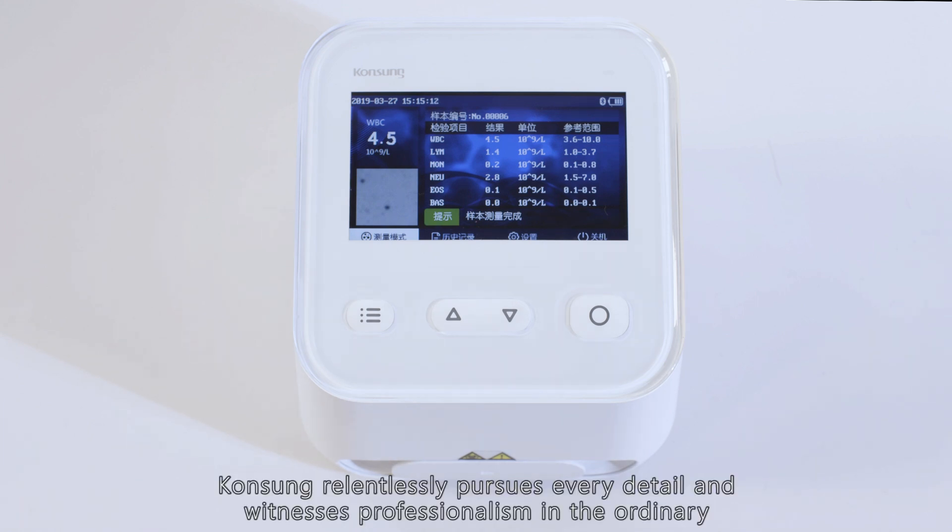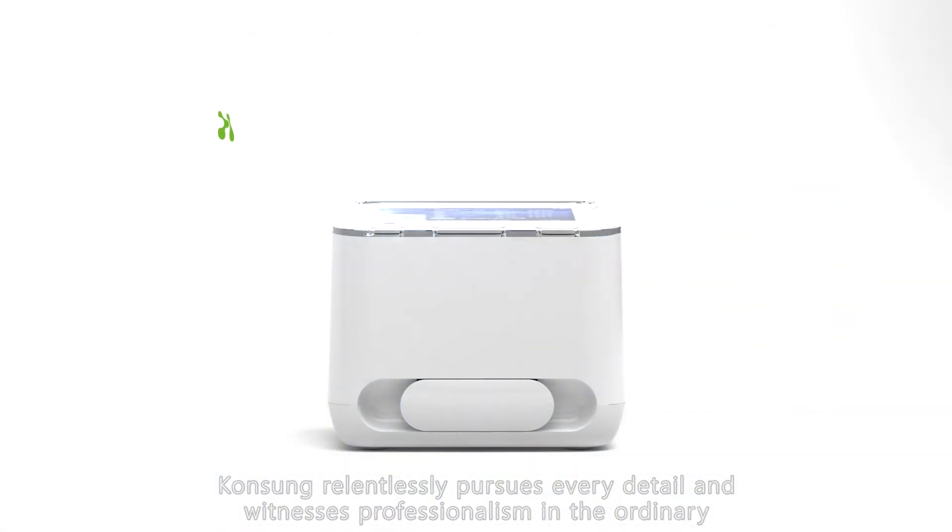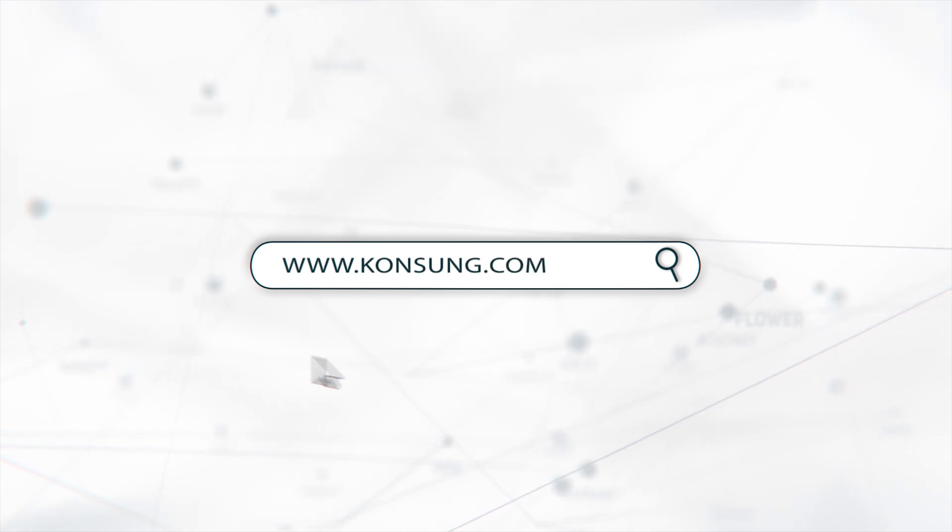Kone Sung relentlessly pursues every detail and witnesses professionalism in the ordinary. The Kone Sung White Cell Analyzer is an exquisitely crafted and precise POCT device.